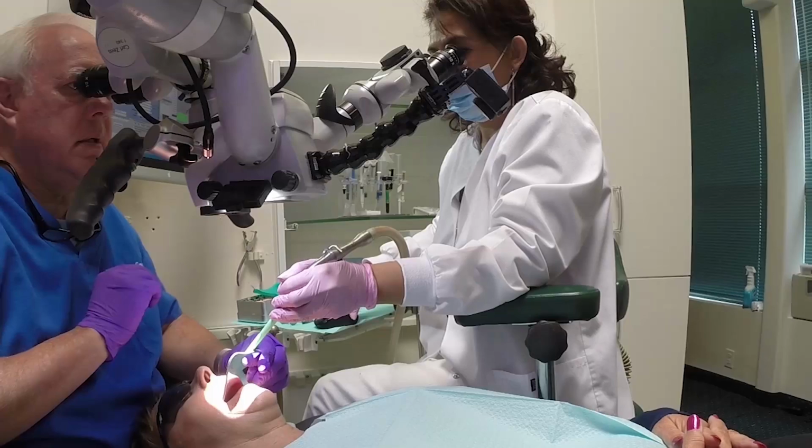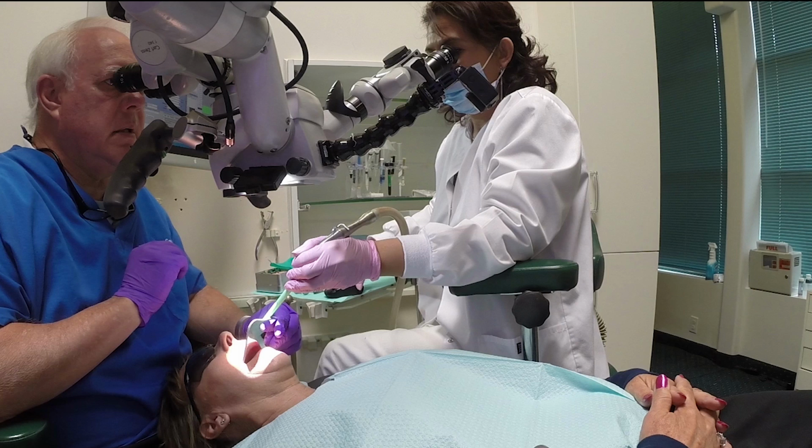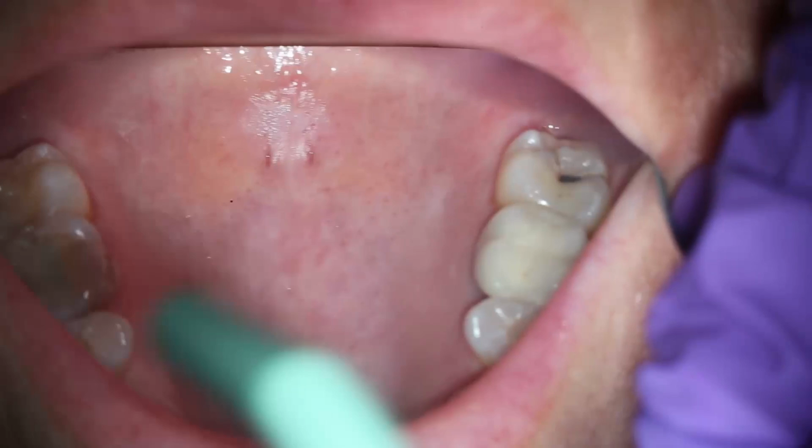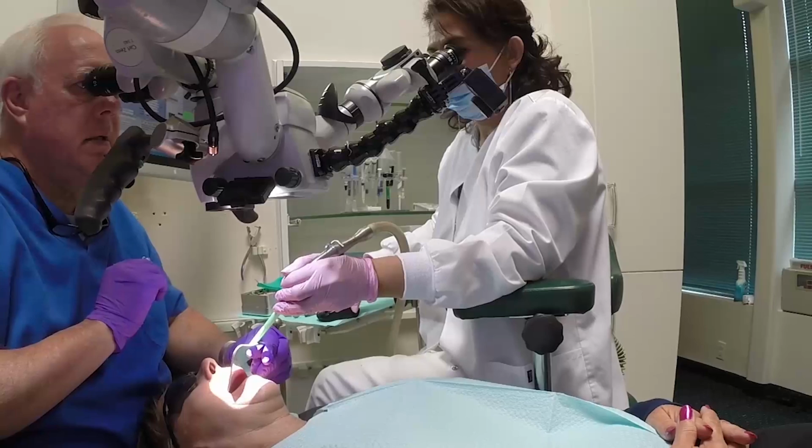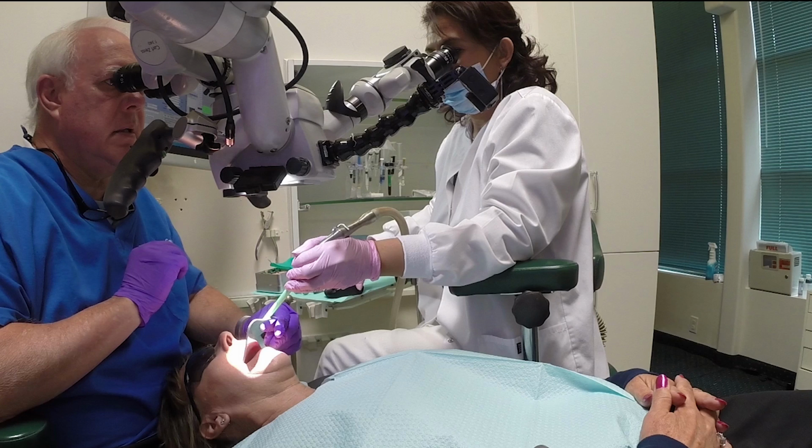So it's actually the ergonomics of the doctor and the assistant that allows you to get really great pictures predictably and let you have the kind of documentation that you want. Joy's support with her chair is very important in this, because without that elbow support, she can't precisely position the suction where she needs to. She's able to hold this position because she has that support on her armrest, and she is muscularly relaxed and able to hold that position without having to constantly look at it.